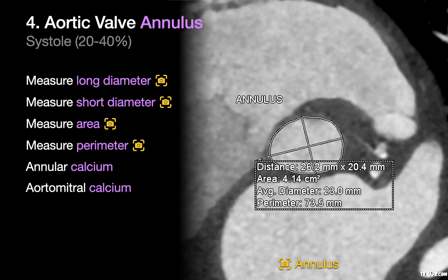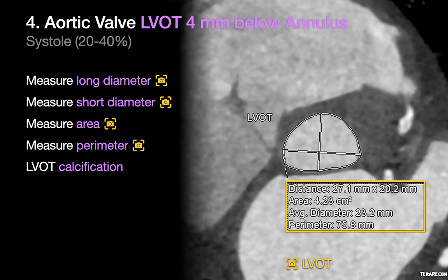Assess and report the amount of aortic annular and aortomitral calcification you see — both are associated with a higher risk of aortic annular rupture during TAVR, especially with balloon expandable TAVRs. You'll then go 4 millimeters below the aortic annulus and measure the left ventricular outflow tract. Calcified and non-tubular LVOTs are associated with poorer outcomes, including paravalvular leak and LVOT rupture risk. Measure and report the LVOT's long diameter, short diameter, area, and perimeter, and do an image capture of the LVOT.